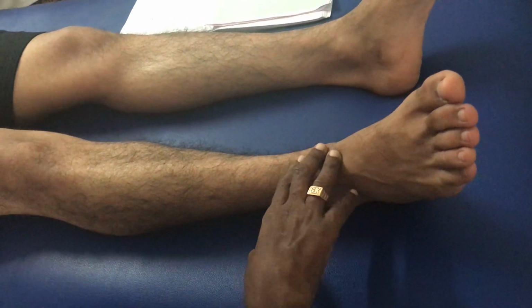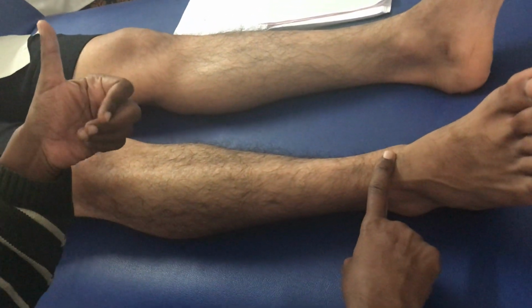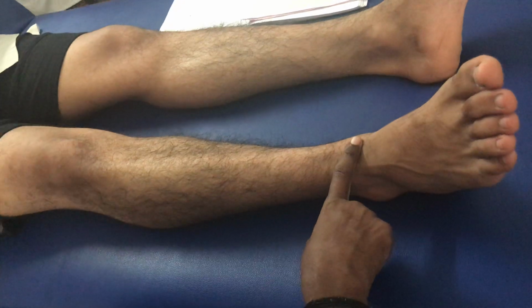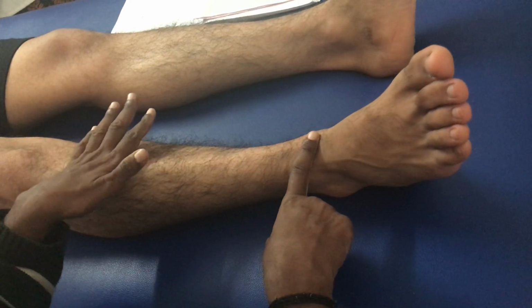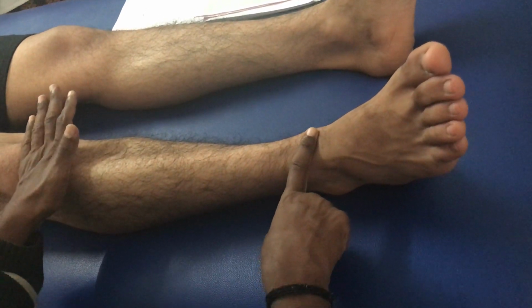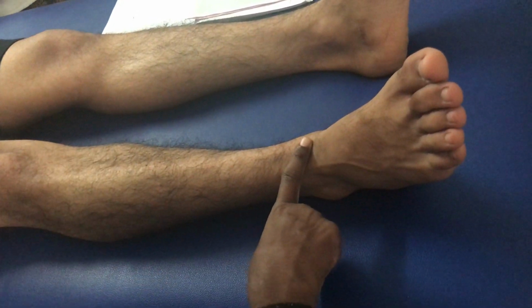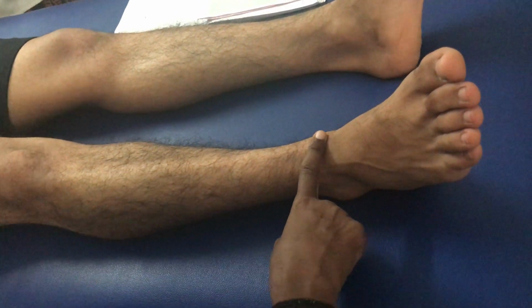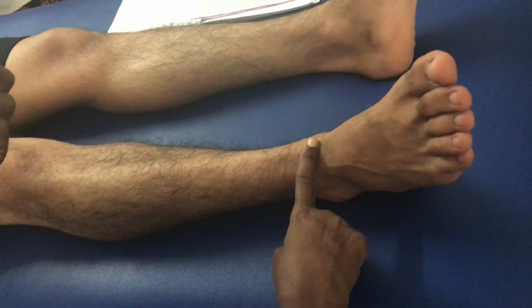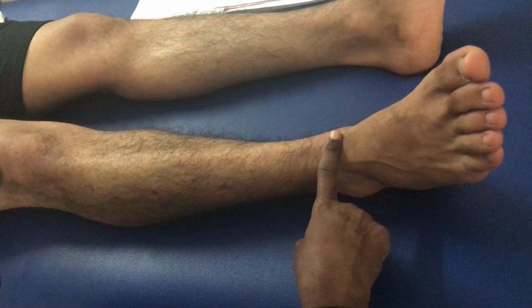Whereas my part is, as a therapist, it is very difficult to judge the strength when you are coming to the lower duration. That's why we never want a visible contraction. Visible contraction, you require more intensity. More intensity will lead to, of course, stronger contraction, and if it is a denervated muscle, it is likely to fatigue sooner. So that's the very reason we go for a minimum palpable contraction, because I don't want to go for a stronger contraction. One. Second thing is even in a visible, it is difficult to judge as you go to the lower durations, because it's going to be just a twitch, and with such a short pulse duration, it will be very difficult to judge. So palpable is easy to judge.